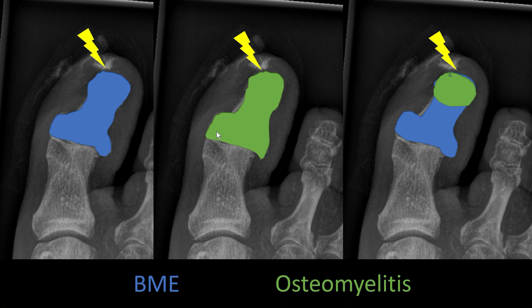In long-standing disease you might get a complete infection of the whole bone — an osteomyelitis of the whole bone like in this case where everything is affected. The most common scenario will be something like this: you have the ulcer, a reactive bone marrow edema which is very extensive and reaching far into the bone, and then you have an area of osteomyelitis.